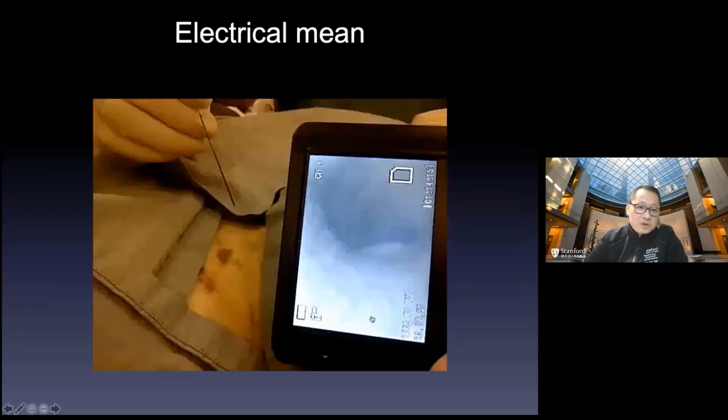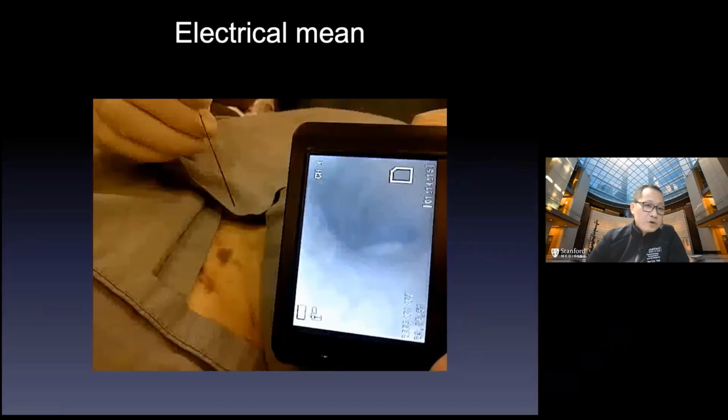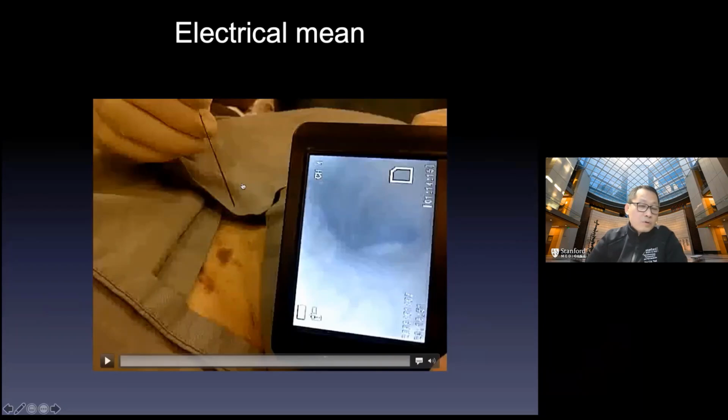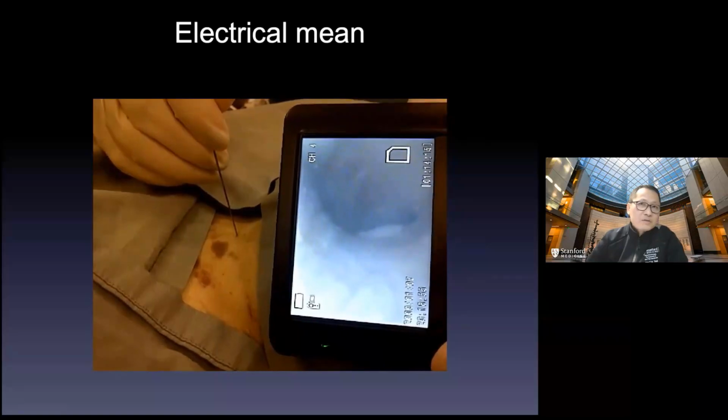In this small study, we put a fiber optic in the cadaver with this insulated needle. We see that when we enter, touching the skin, it makes a connection. And when it pops into the airway, you can see here the changing tone. So it can actually guide you. Using this method, you don't need a third hand to do it. Now you can hear that changing tone.